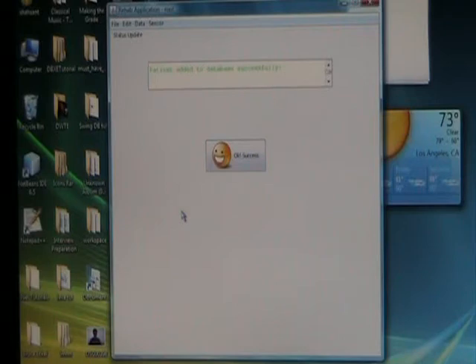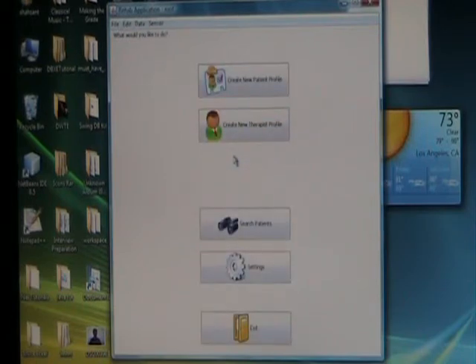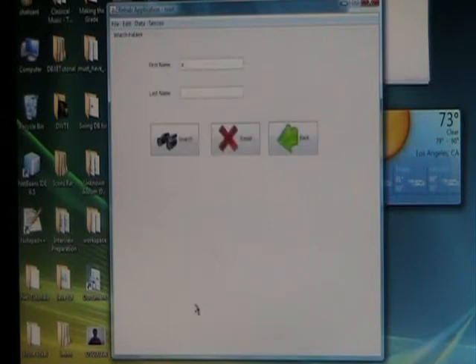And let's just quickly add him to the database, and we have feedback to see if the patient was added correctly to the database. If it's successful, we get a message saying success, and it'll take us back to the task selector. And once we have added the patient, let's look for him so we can begin a new session to get measurements. For example, his name is Andrew, so let's search for him by his first name.